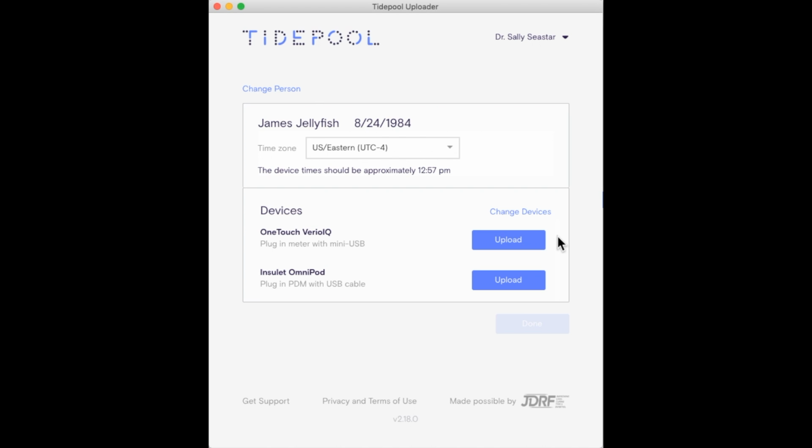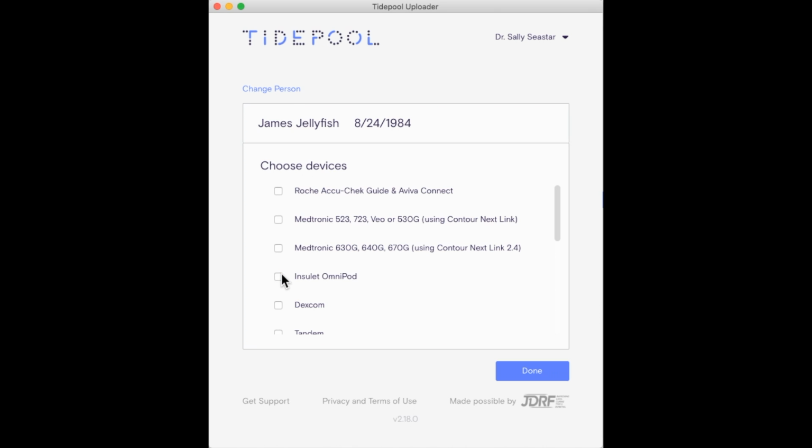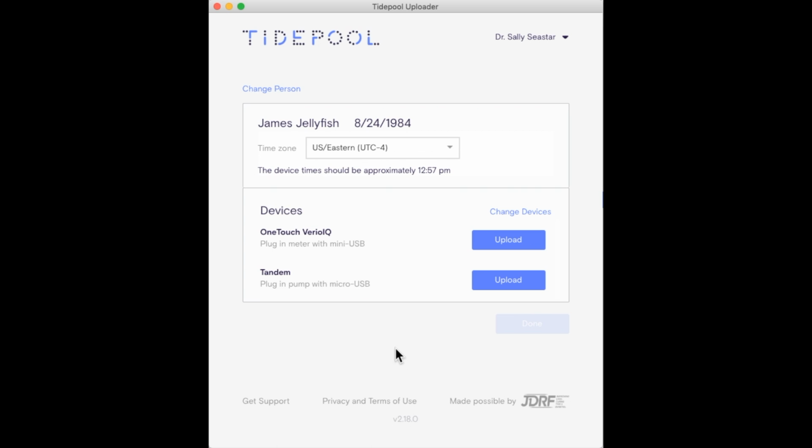However, if this patient were to be changing insulin pumps from an Omnipod to a Tandem pump, for example, this would be accomplished within Tidepool Uploader by clicking Change Devices, unchecking one box, and checking another. And within a matter of just a few clicks, you're ready to upload data from a Tandem insulin pump to the exact same patient account without having to change diabetes software.